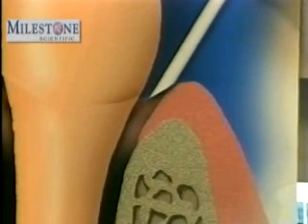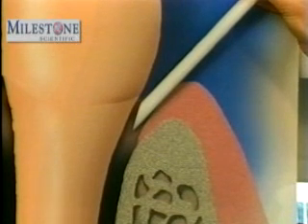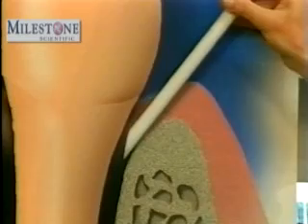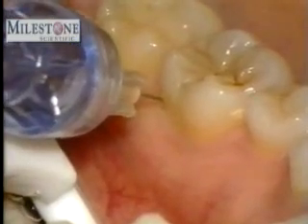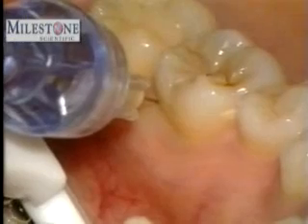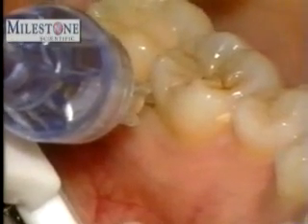This can be corrected by simply having the bevel of the needle facing the tooth and advancing your needle with the bevel in contact with the tooth until resistance is met. This will prevent the needle from becoming obstructed with bone. Now that you've had an opportunity to review the periodontal ligament injection with the wand, we believe you'll find this an excellent technique which is predictable, easy, and more comfortable for your patients.